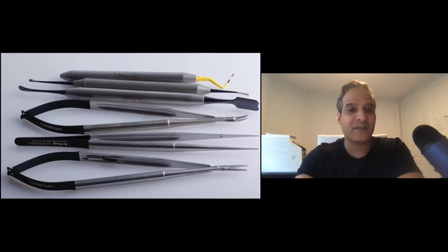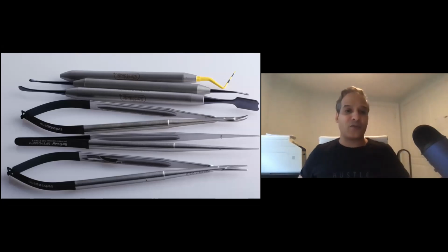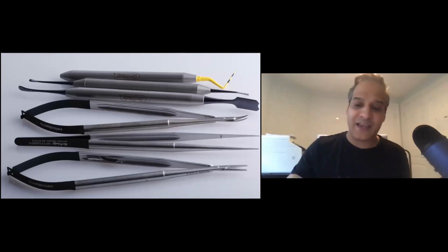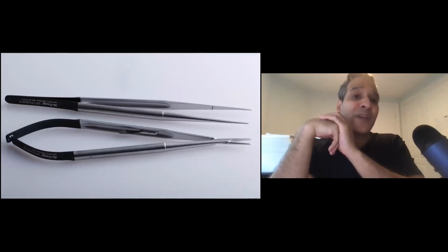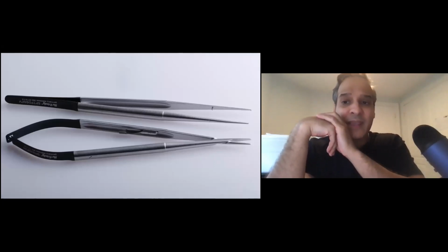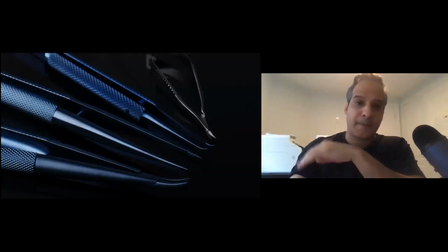From a productive hourly point of view, you get your money back when you use nice instruments, because it's less of a hassle. The main things for tissue grafts are a nice tissue forceps and a nice needle holder.